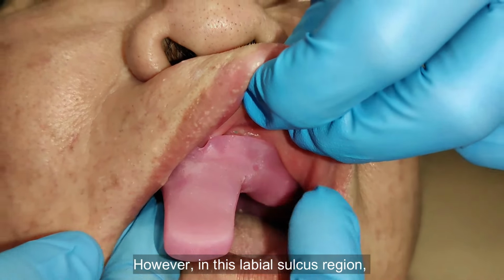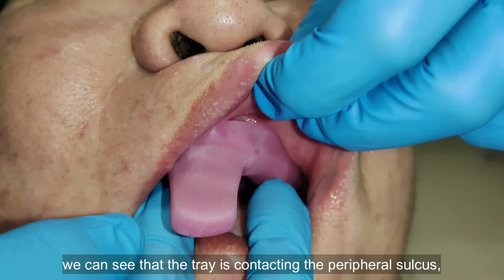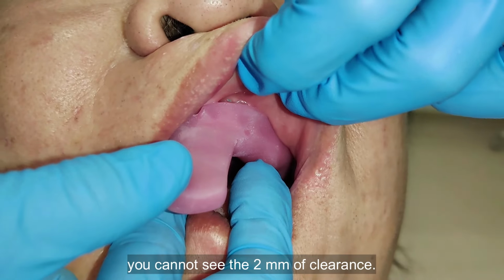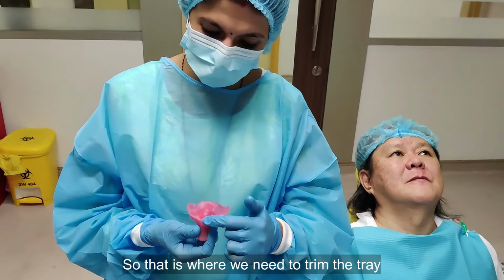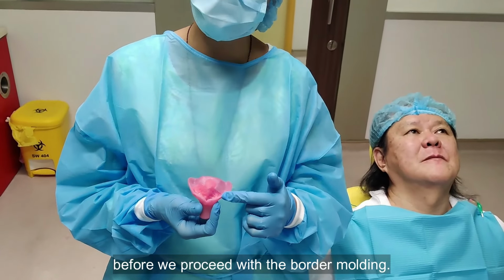However, in this labial sulcus region, we can see that the tray is contacting the peripheral sulcus. You cannot see the 2 mm of clearance. So that is where we need to trim the tray before we proceed with the border molding.